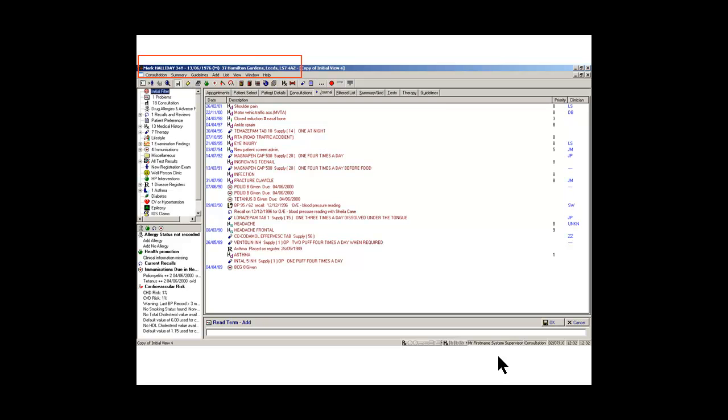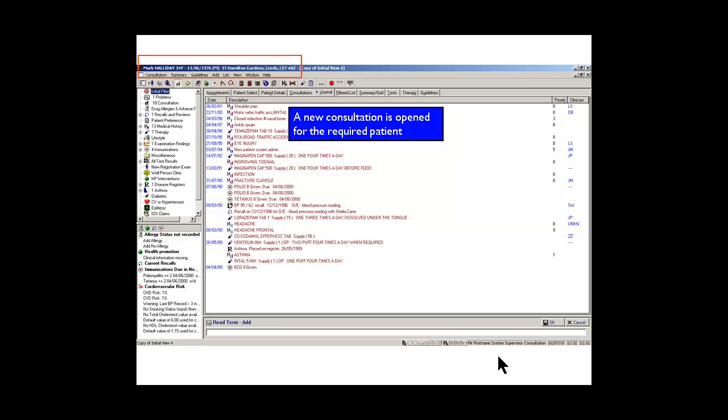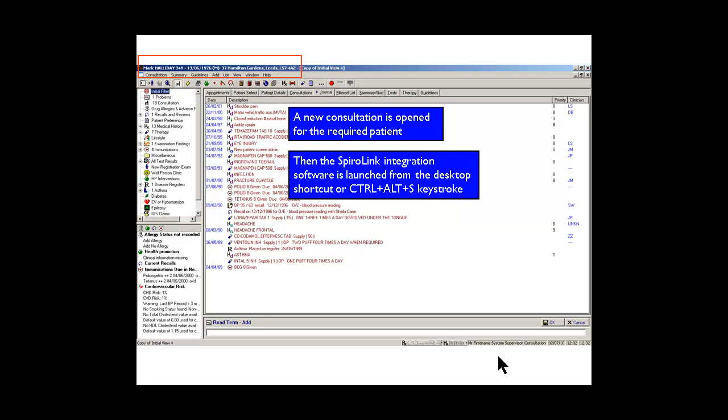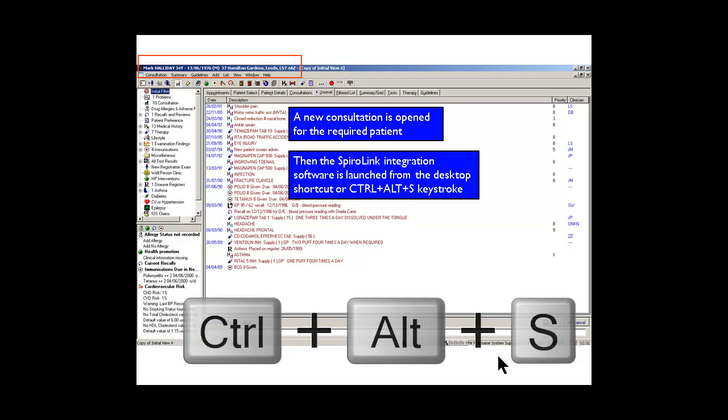First of all, we go into the patient record. The new consultation is opened. We can then initiate the SpyroLink software by pressing Ctrl, Alt and S on the keyboard.